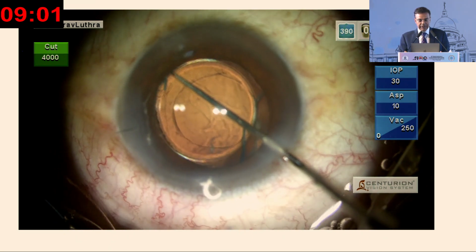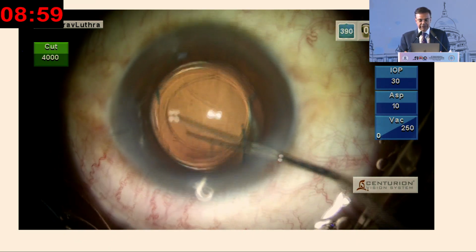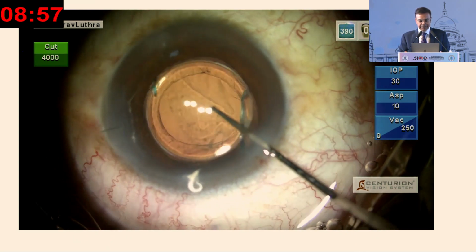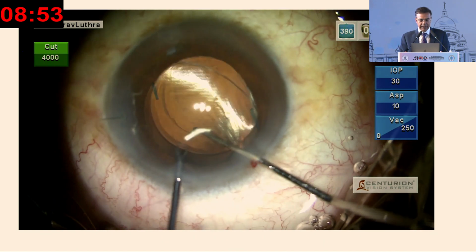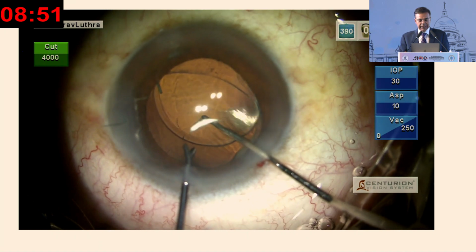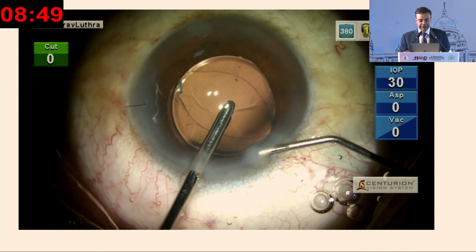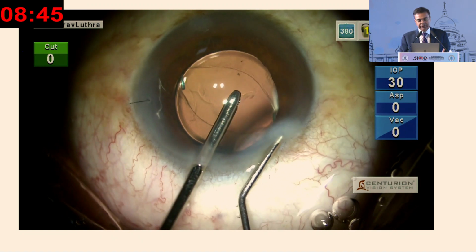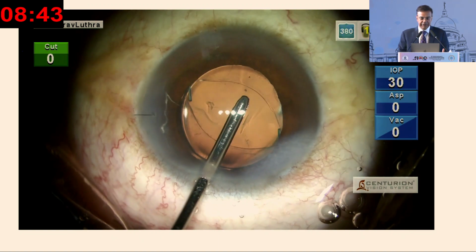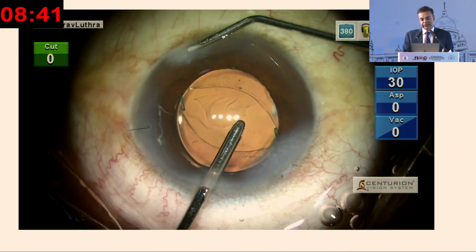The surgeon who had done the surgery had been wise enough to put in a 3-piece lens, but because the PC rent might have enlarged, it had got dislocated. Now if he had done an anterior optic capture, nothing would have happened. The IOL would have remained nicely in place, and all I had to do in this situation was clear all the vitreous and then just relocate this lens.